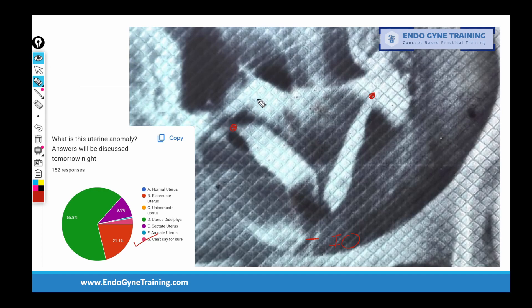In an HSG film per se, without any other diagnostic modality, it is impossible to know what is the external contour of the uterus. If this is a septate uterus, the external contour would be like this. However, if one were to argue this is a bicornuate or didelphys uterus, the external contour would be like this. But in an HSG film, it is practically impossible to tell what the external contour is. Hence, an HSG film by itself is insufficient information to tell us whether this is septate, bicornuate, or didelphic uterus.